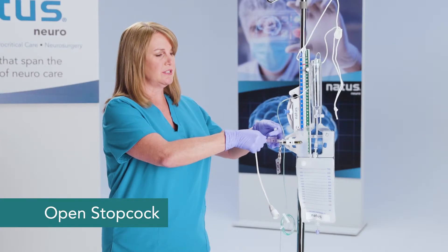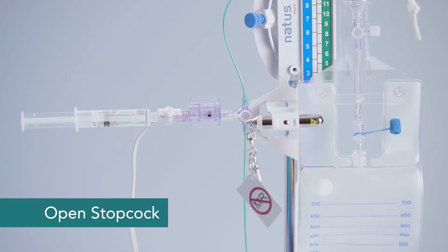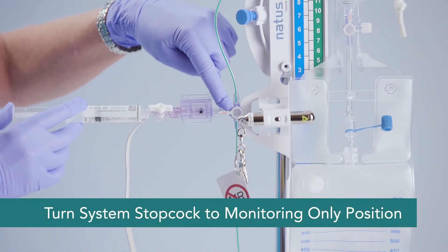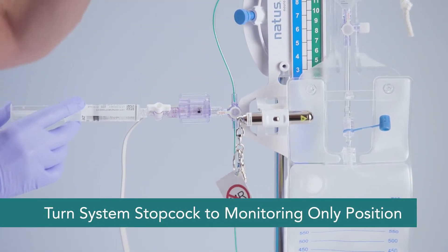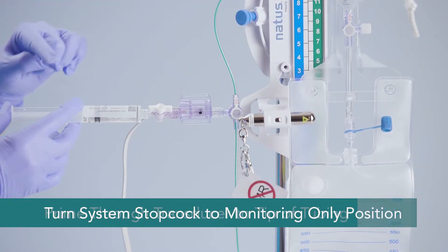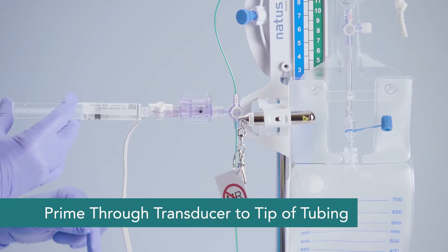With the transducer I'm using, I'll need to open up my stopcock here — the one that you have at your facility may look different. I'll turn my system stopcock off to the burette. We would call this the monitoring only position, and prime through the transducer and down to the tip of the tubing.